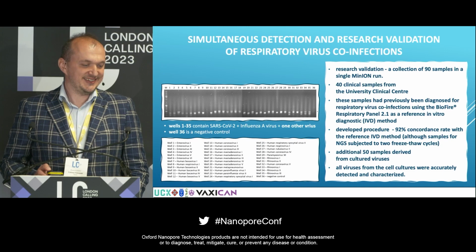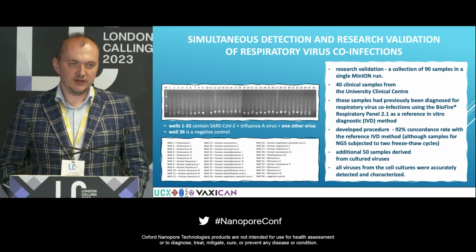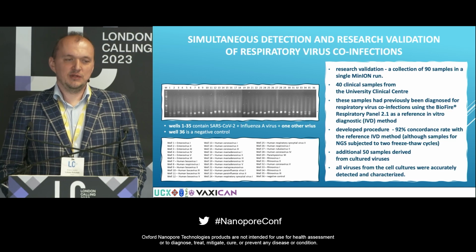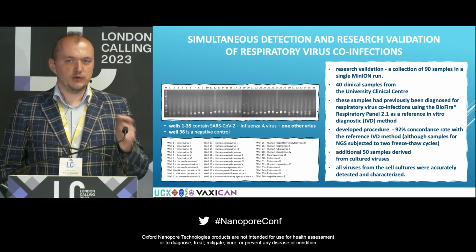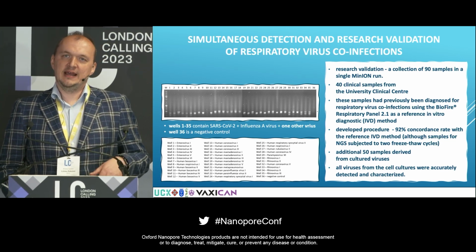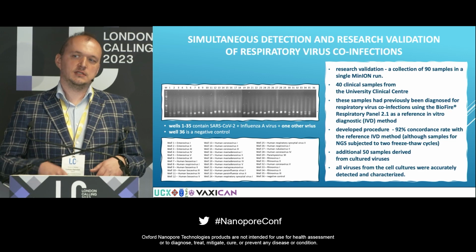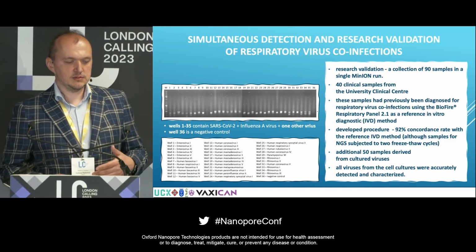I hope so. We also did some research validation using clinical samples. Those samples, when they were fresh, were analyzed by IVD methods, and then there was freeze, defrost, freeze, and you know how it is.